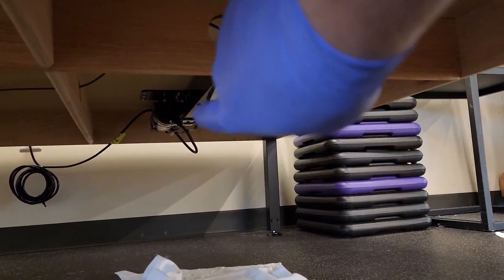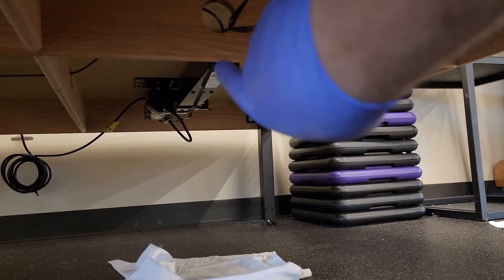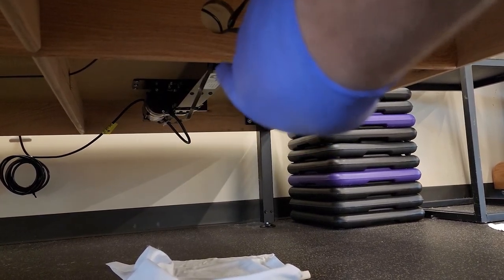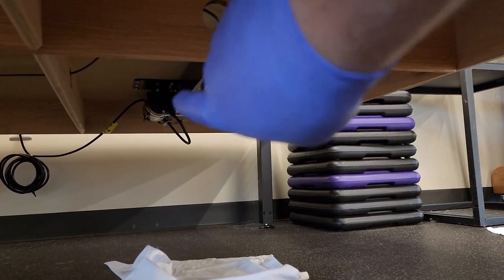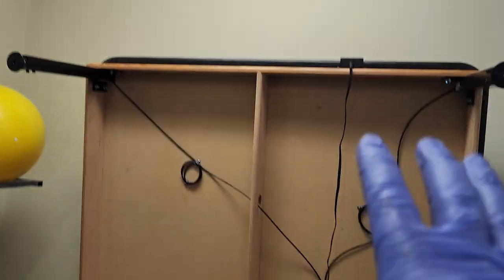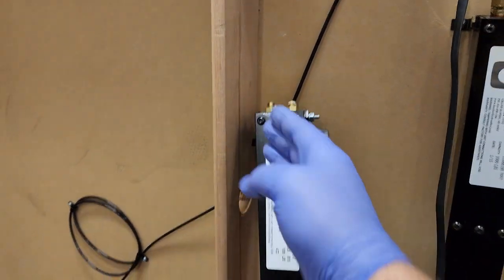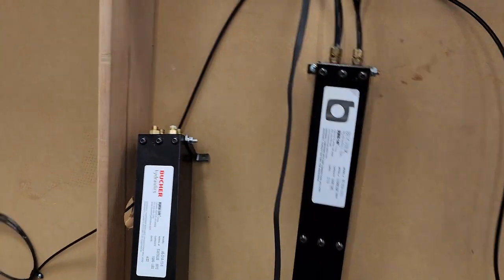So we're gonna go ahead and flip this up on its side so that the oil stays in the cylinder, because since the ports are at this end, we're gonna flip it up so that we can disconnect all of these down here without getting oil all over the place. And we're gonna swap that guy out and see how it goes. So this is the underside of the table. We flipped it up on its side because these here are your ports. You want to keep the oil down inside the cylinder. So that's why the whole table's flipped up.